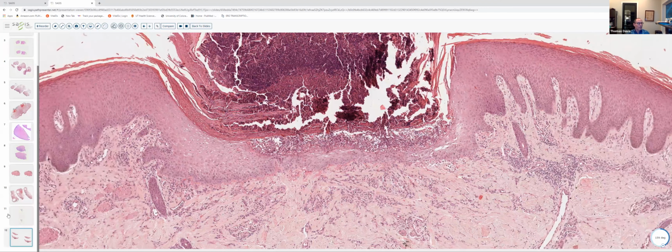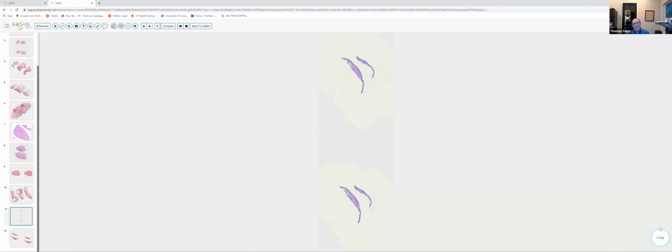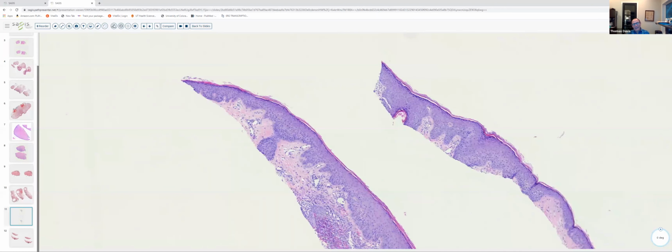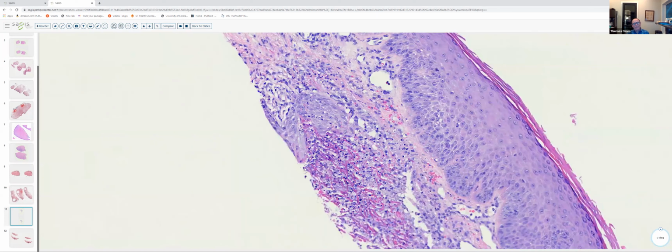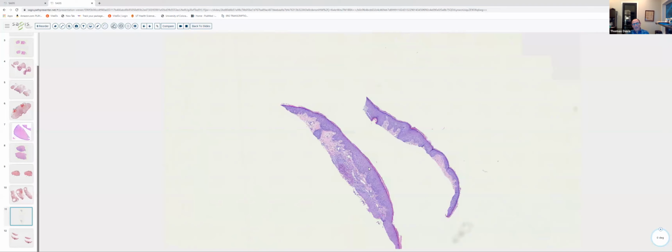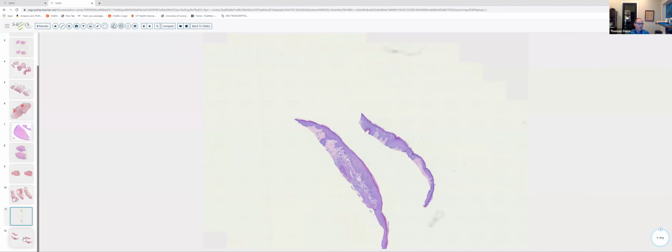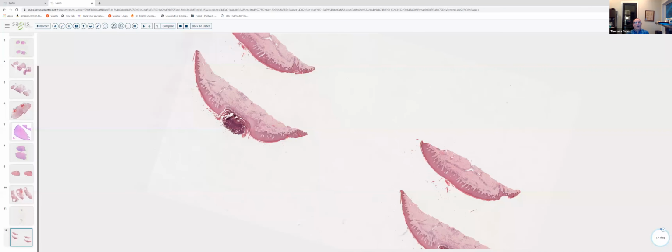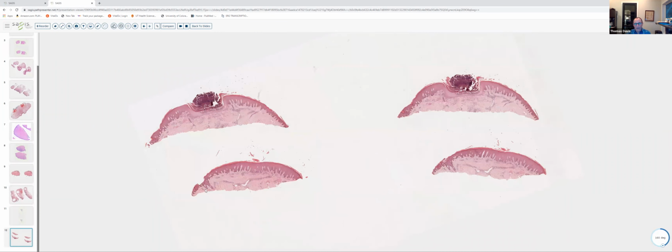In EPS, I'm going to go back there. The fibers, again, are typically narrow, and the elimination channel is much narrower too. It's almost as if the elastic fibers are being sucked up in a vacuum cleaner. And the elastic fibers are clearly increased in number in EPS. So clinically, not too much difficulty distinguishing them, but histologically, sometimes it can be a little bit of a challenge. So look for a broader transepidermal elimination channel in reactive perforating collagenosis.